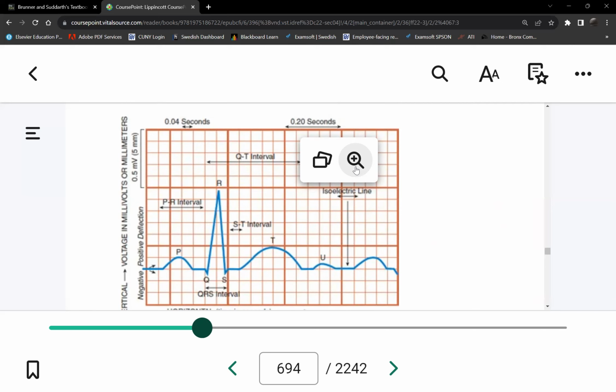Now, in ST depression, on the other hand, it's still a heart attack. However, it's not a full thickness infarction. Yes, some cells died, but only this part died. There are still living myocardial cells here, meaning the heart attack is not so severe. Yes, the patient had a heart attack, but blood flow was restored. So it only killed off a section of the thickness of the muscle. Therefore, it still repolarizes, but not all are repolarizing. Only these are repolarizing. So that would appear that way.